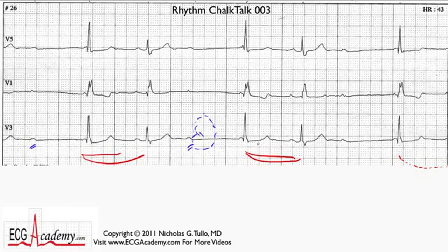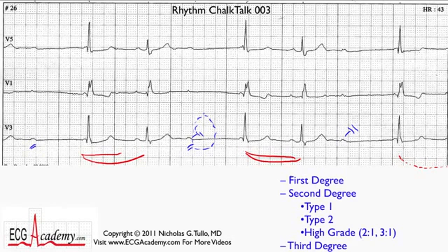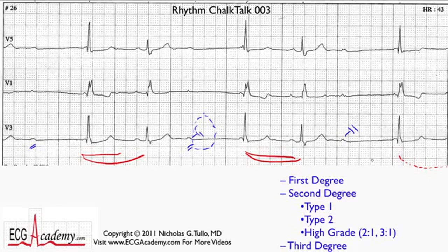Here's another one over here that seems to be non-conducted. So there's a pattern with a non-conducted P wave followed by two QRSs, and then another non-conducted P wave and so on. Let's review our classification of AV block. Because a lot of people would look at this and say, well, there are P's and there are QRSs and they're all over the place — could this be third degree complete heart block? And the answer is no.